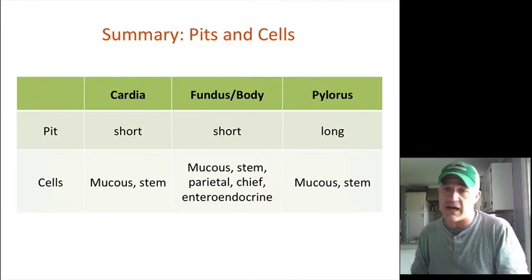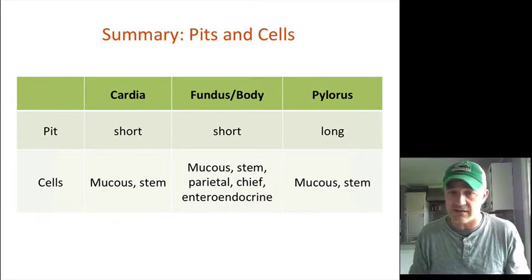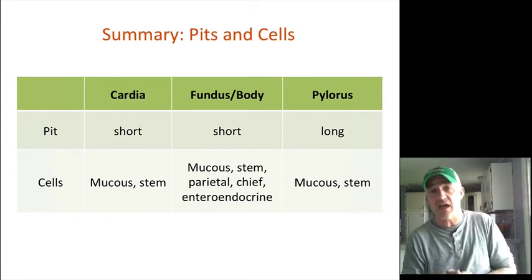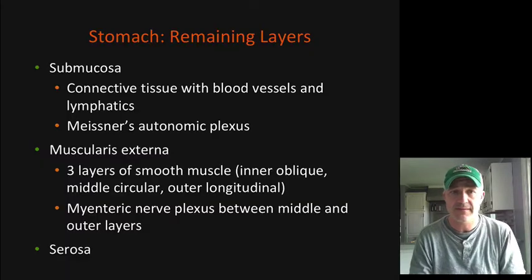Where the fundus and body cells here, they're going to have more of these glandular cells in here, those parietal and chief cells, which, like I said, are definitely going to be cells I'm going to have you identify when we actually go and look at the digital slides.